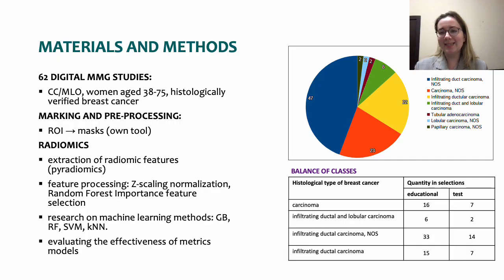We analyzed 62 digital mammographic studies in standard craniocaudal and mediolateral projections of women from 38 to 75 years old. Digitized analog studies were excluded, as well as studies of patients after mastectomy or resections. Correspondence of the data of radiation diagnostic and data from the cancer register was checked for a time interval of no more than 1 month between them.